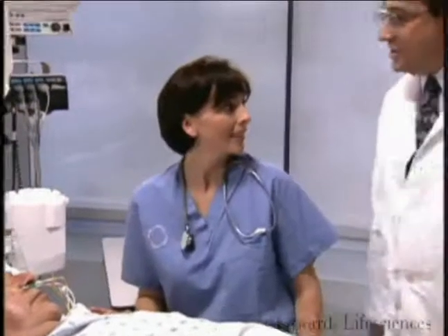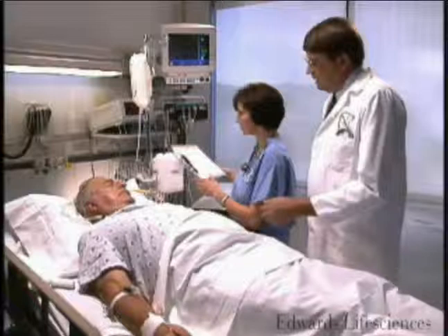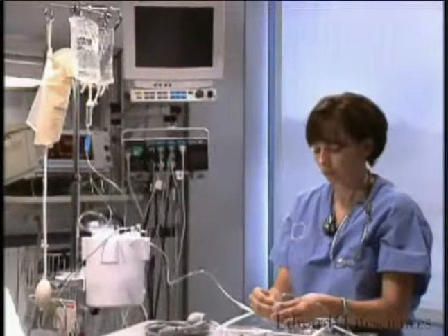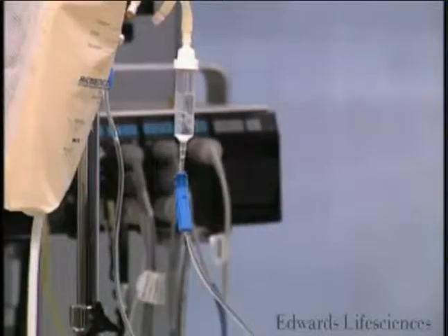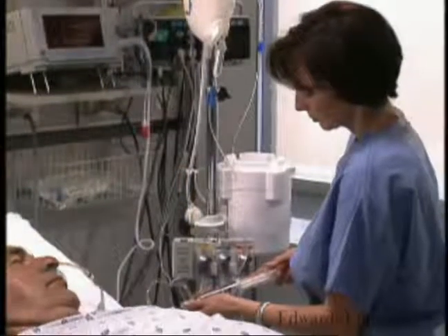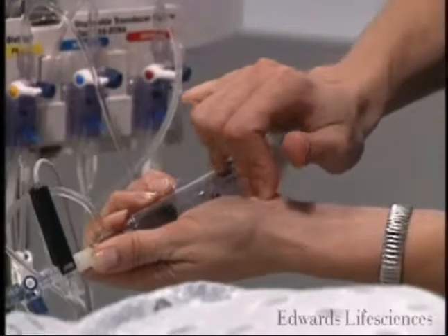Invasive pressure monitoring, whether central venous, arterial, or pulmonary artery pressure, is commonplace in the critical care setting today. The clinician must maintain certain practice principles in order to assure the validity of data obtained. This video will review some essentials of invasive hemodynamic pressure monitoring, as well as present troubleshooting techniques specific to bolus cardiac output and mixed venous oxygen saturation monitoring.